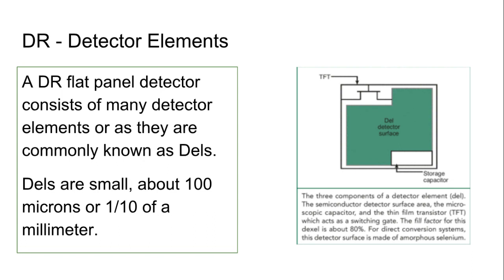Okay, but the little tiny DELs, and you see one giant magnified one here, this also will allow you to see why flat panel detectors are so expensive.